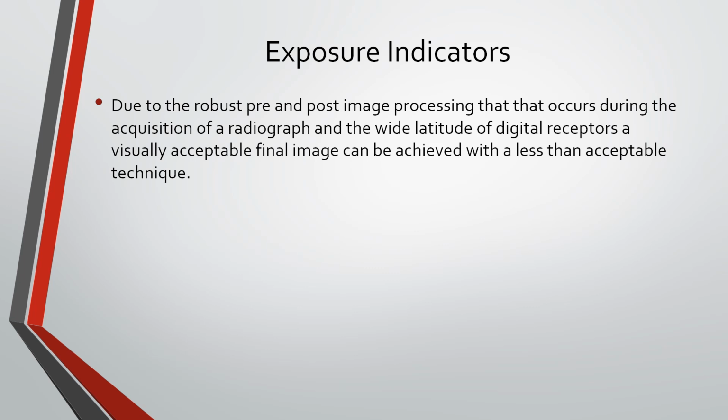Okay, so our goal is to have a proper technique. Due to digital processing and the wide exposure latitude afforded by the digital receptor, it's possible to not be using the best or proper techniques, and the image could still look acceptable. All right.